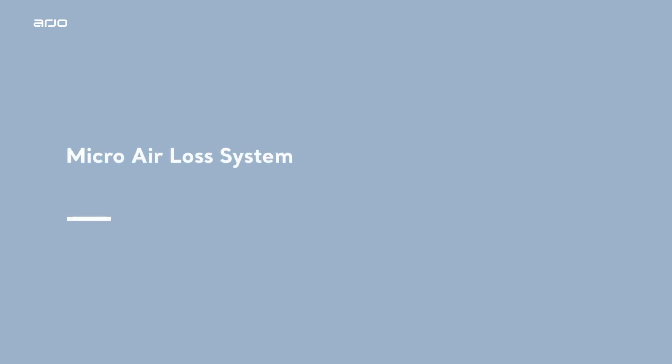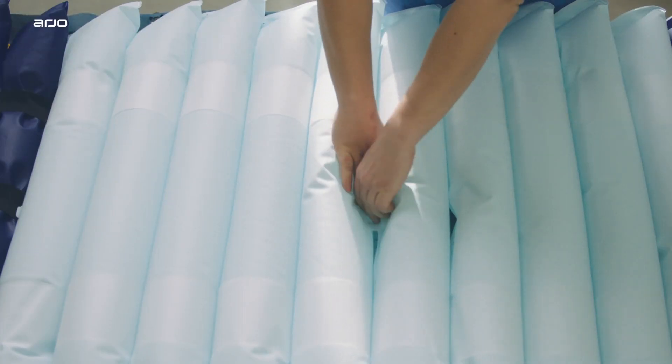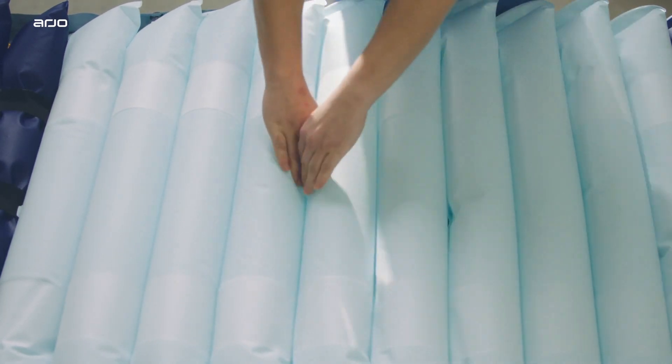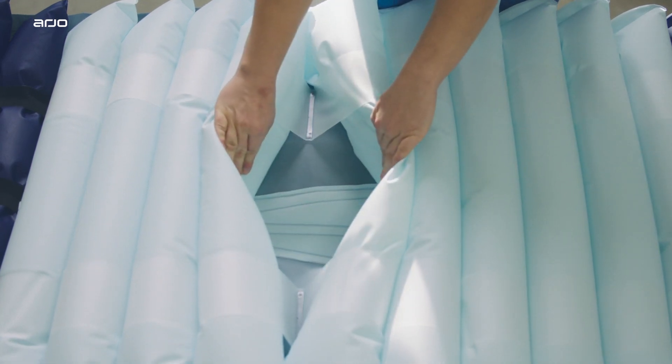Micro air loss system. Incorporated into the base cover, the micro air loss system introduces air surrounding the cells to help reduce heat build-up within the mattress.